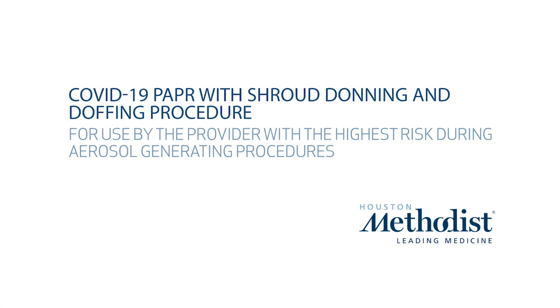COVID-19 PAPR PPE Donning and Doffing Procedure. For use by the provider with the highest risk during aerosol generating procedures.